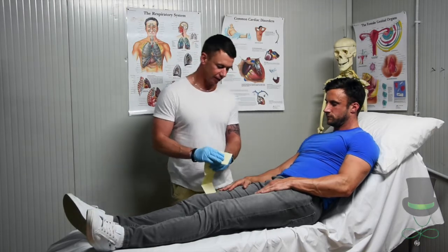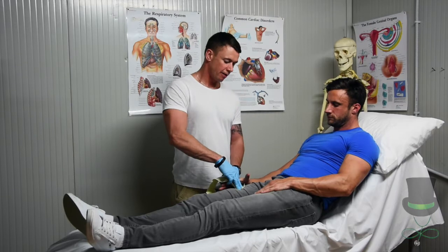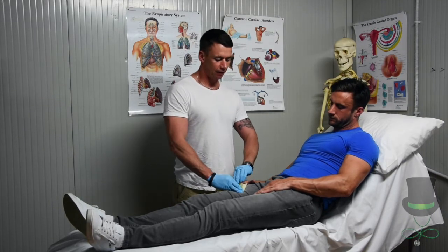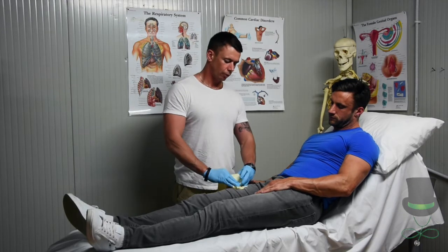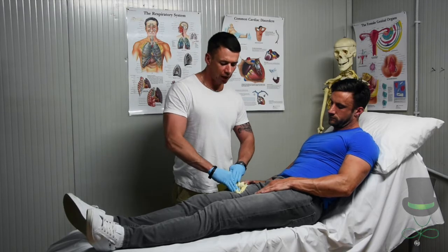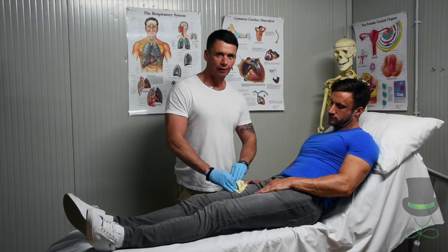Placing the gauze on its sterile surface, using a two-handed technique, keep the pressure on the hemostatic gauze whilst packing it into the wound, ensuring pressure is applied at all times.